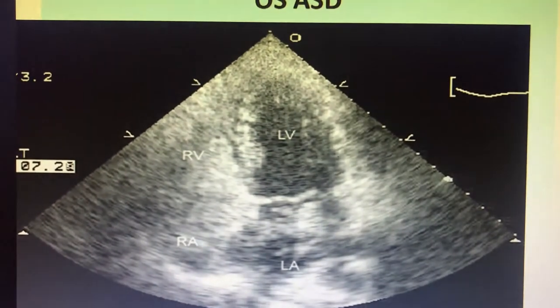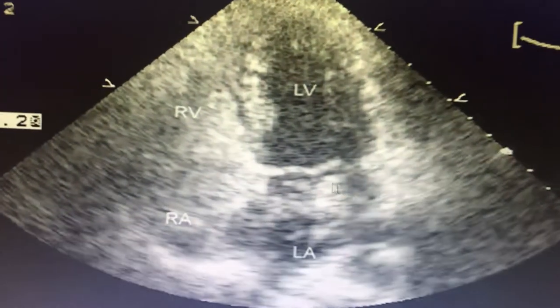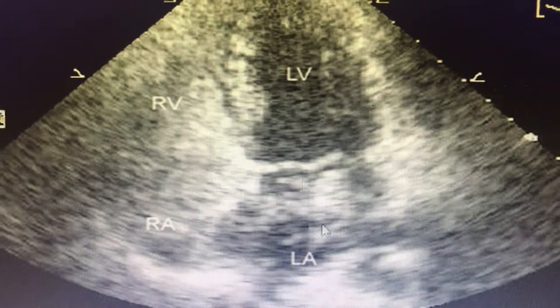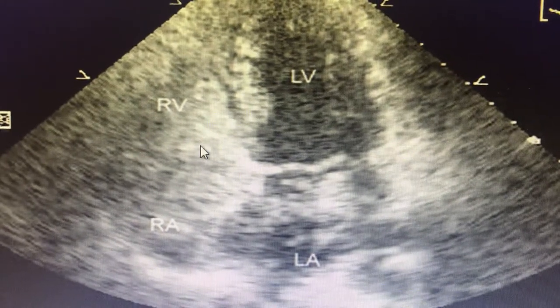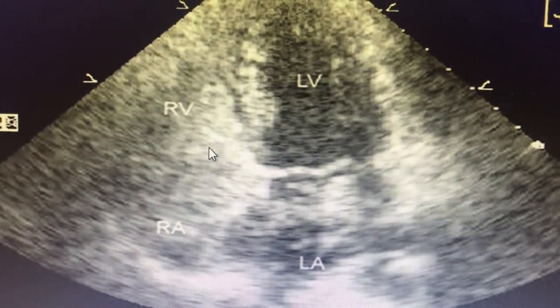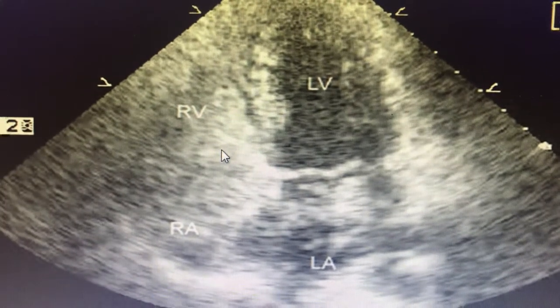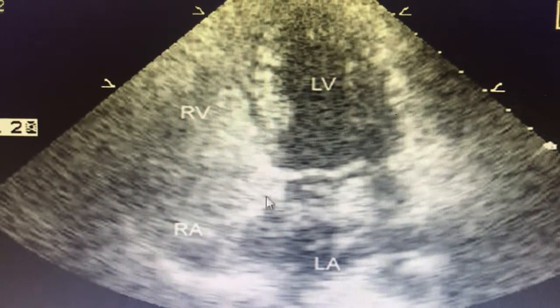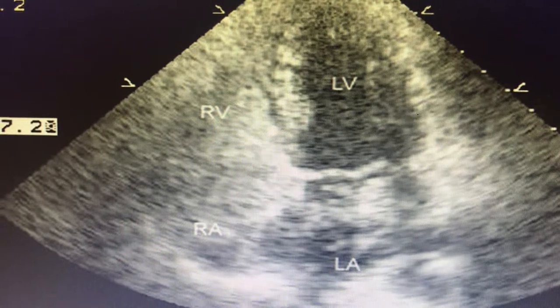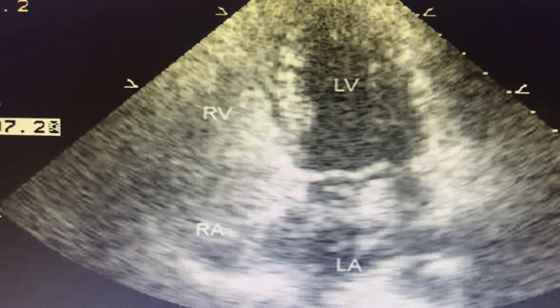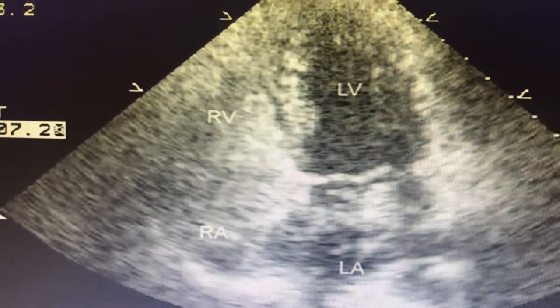Here is an example of an ASD with contrast filling into the LA. You can see that the RA is getting contrast-filled, and agitated saline is getting spilled into the LA during a respiratory response — specifically, during expiration it is getting into the LA.